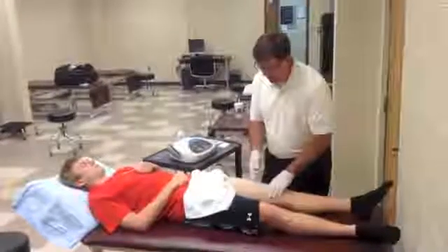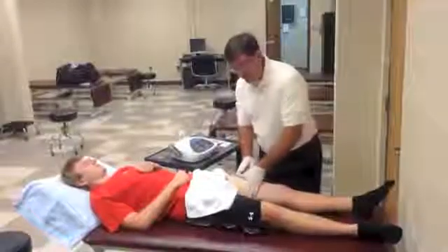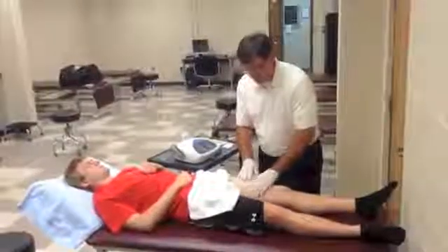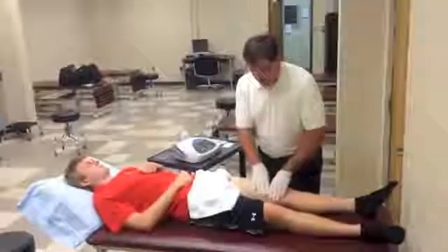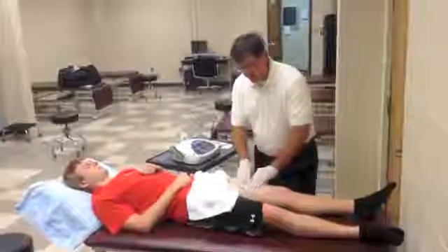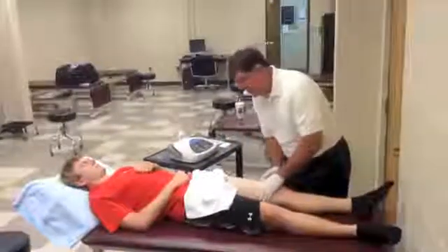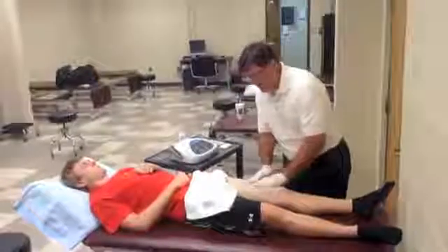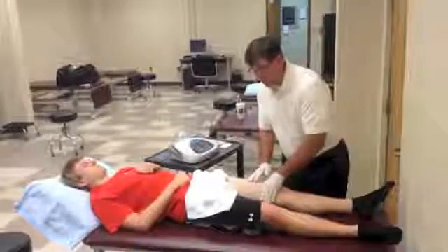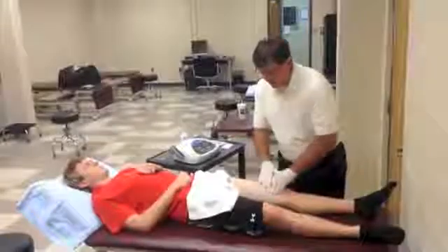I've used a powder as a medium so that I can move smoothly and absorb any moisture, and as I said I'm wearing these non-conductive gloves. This allows me then to do whatever amount of pressure or direction of pressure that I think is appropriate.